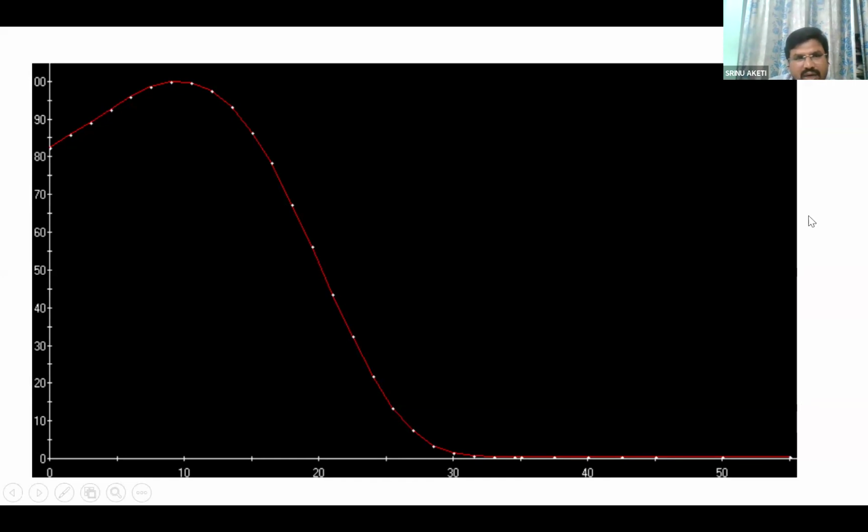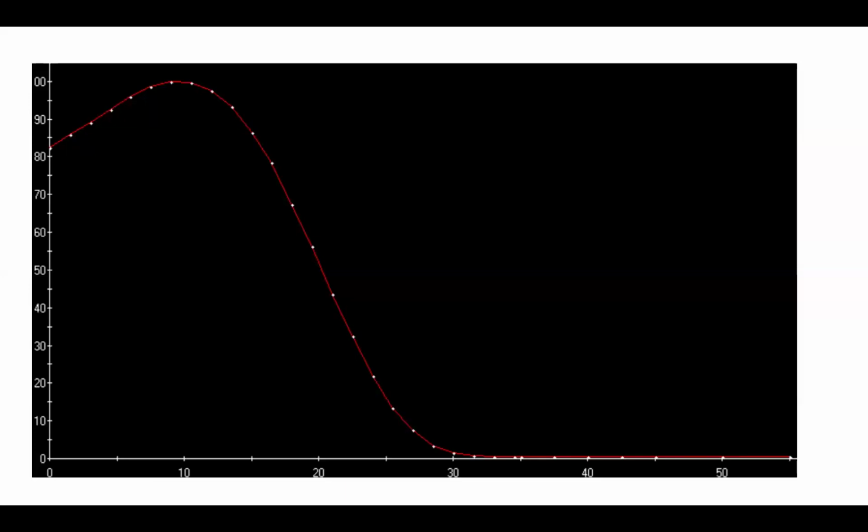Bremsstrahlung radiation. I'm talking about electron. Am I right? You said this is an electron PDD, but you said this is Bremsstrahlung. How is it Bremsstrahlung? Sir, when the electron interacts with the matter, the interactions mainly. Then this should also be Bremsstrahlung, no? Yes, sir, it will also be, sir, but the dose will never be zero, sir, once the electron completely loses its energy.